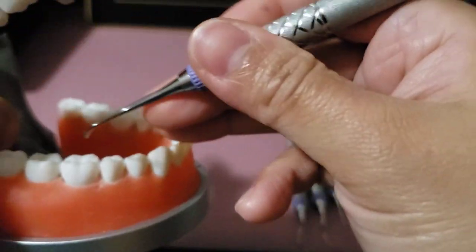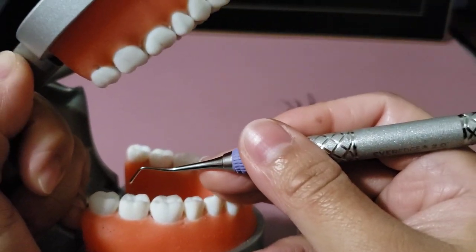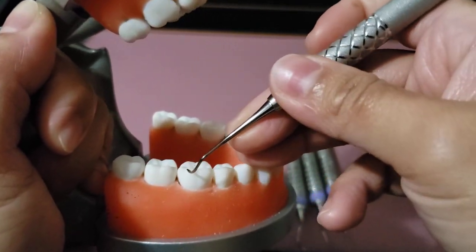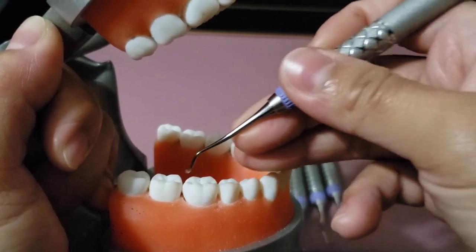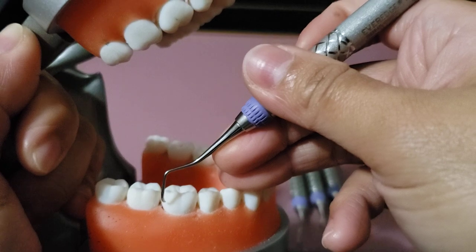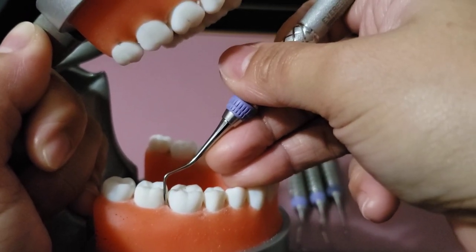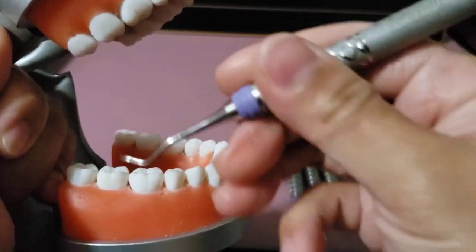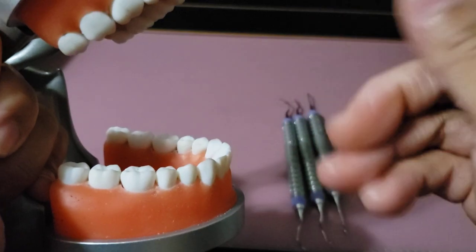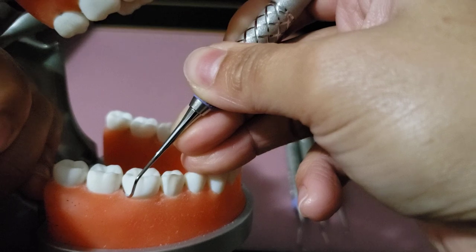The working order is always from the most distal tooth going forward. To identify the correct working end, place the instrument in the proximal — it is correct when it stands parallel to the long axis of the tooth. If it is hugging the tooth in an incorrect angle, that side is incorrect.